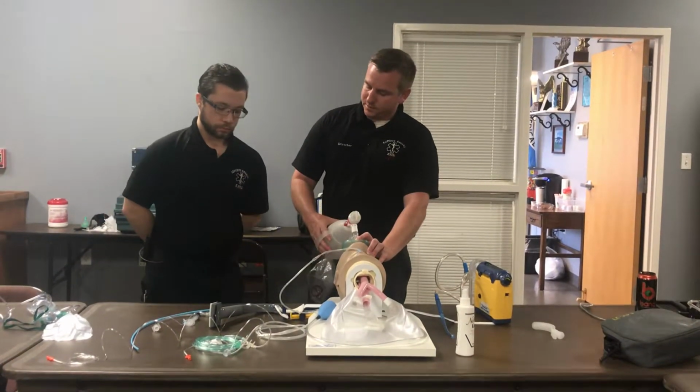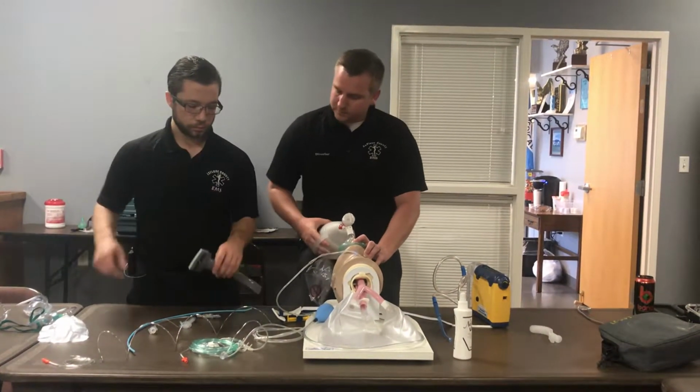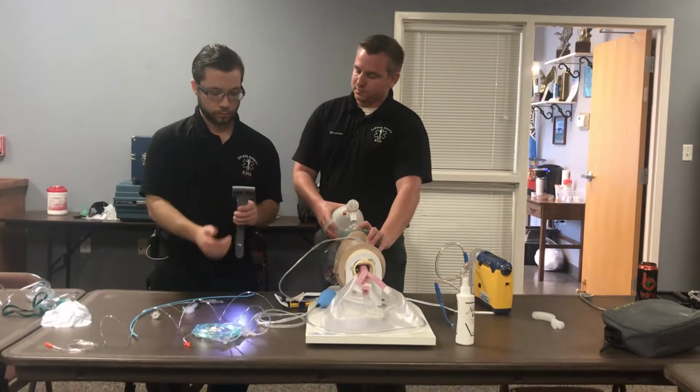So Levi has got his King Vision, he's checked it, it works.